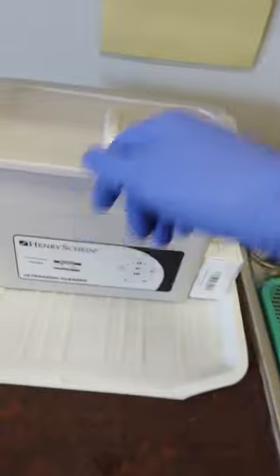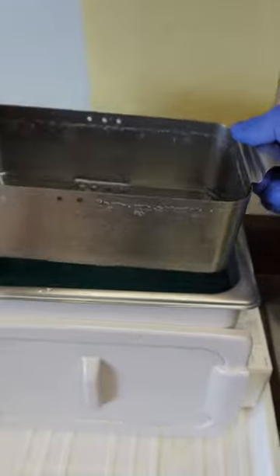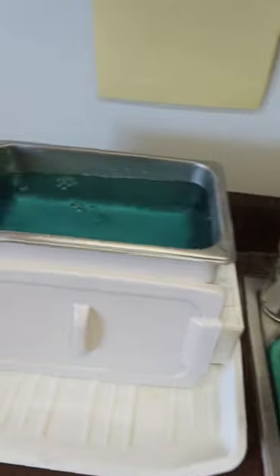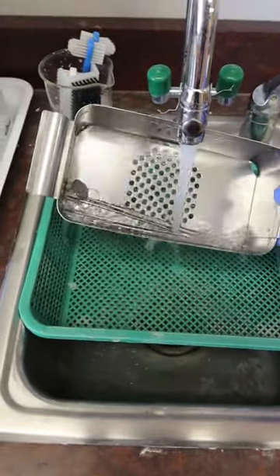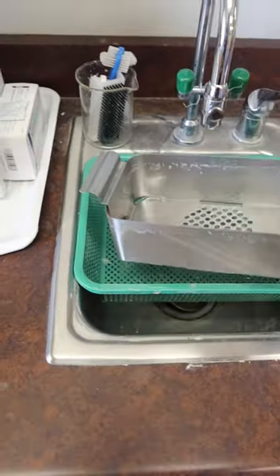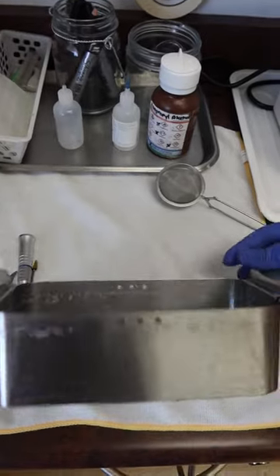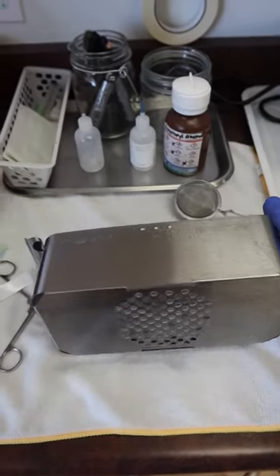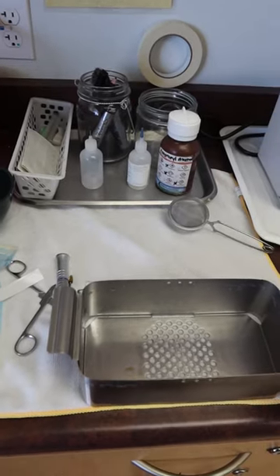Once our instruments are done and fully shaken, we can remove the lid and take the basket out to attend to our instruments. Because the water takes the brunt of every single patient throughout the day, we want to give everything a good rinse and wash. Then take the instruments over to the drying area and flip the basket away from you so we don't risk anything falling onto our feet or contaminating ourselves, keeping everything clean.